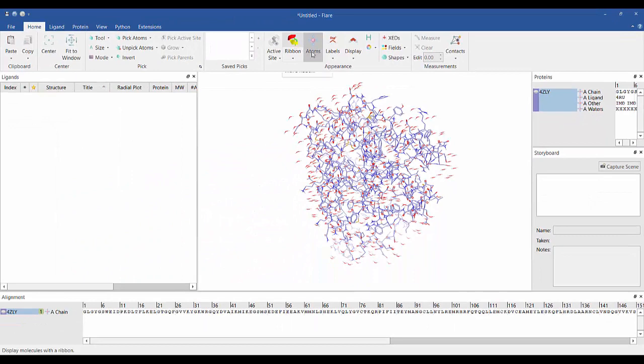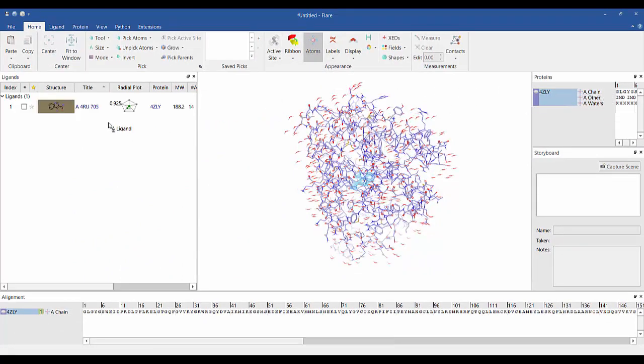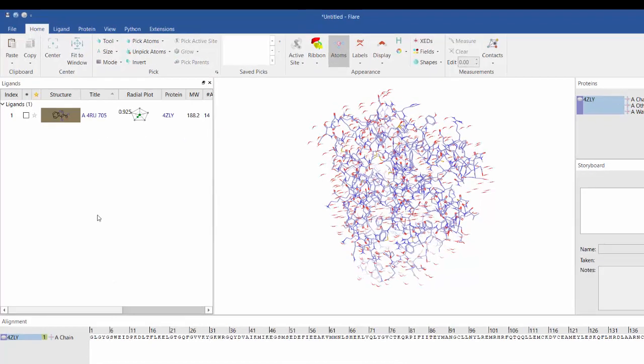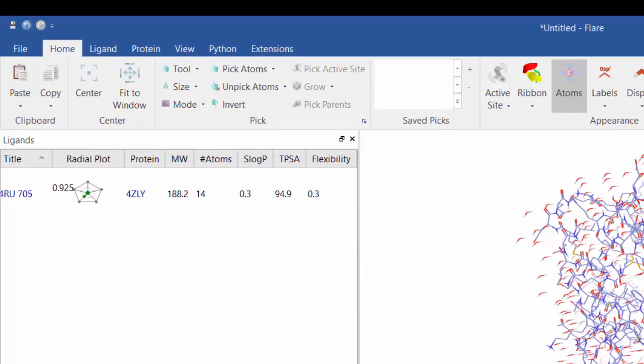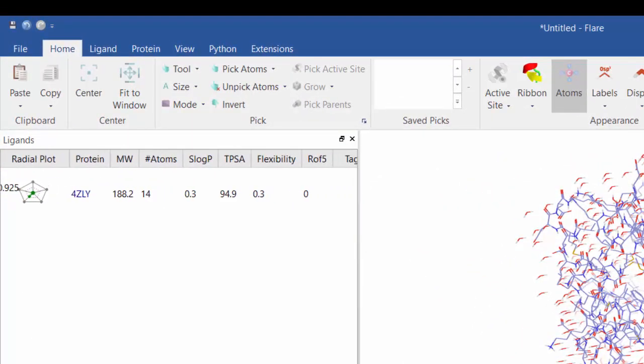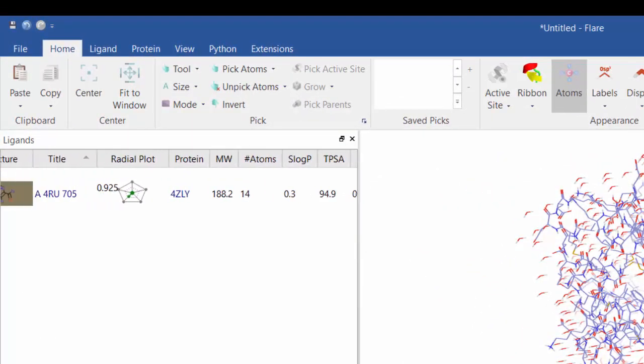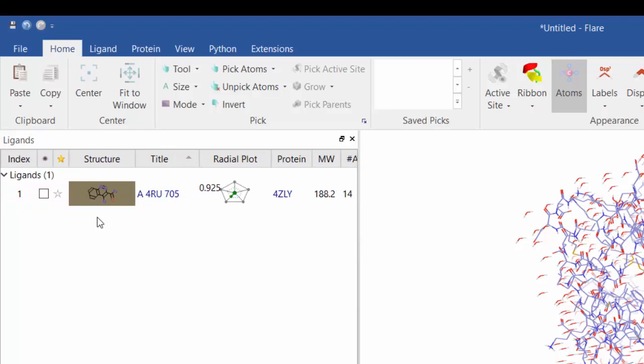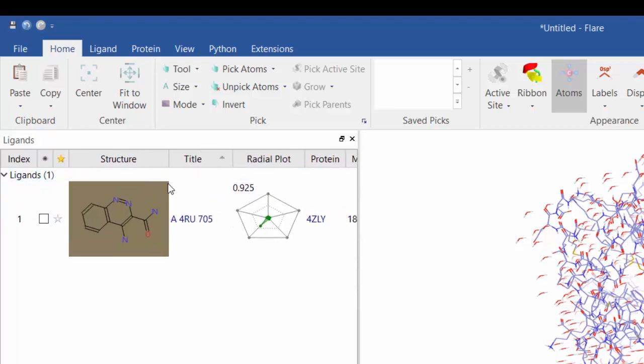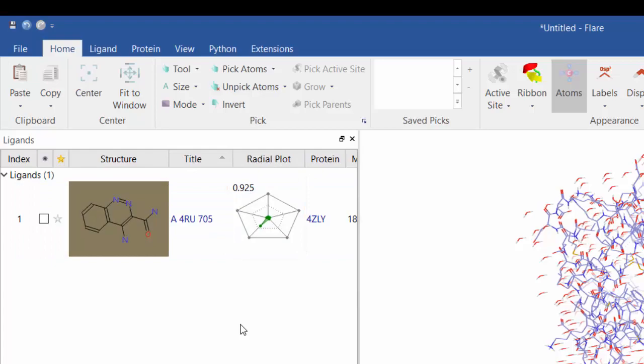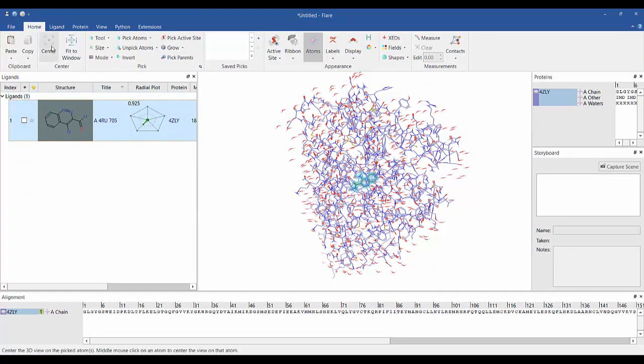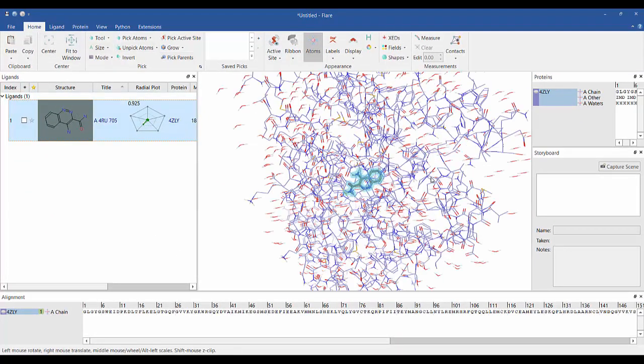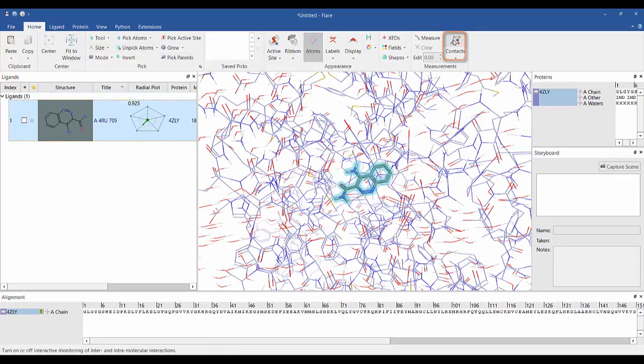Flare supports drag and drop, so the native ligand can be moved to the ligands table where you can view all physicochemical properties for the ligand individually but also conveniently combined into a radial plot. Flare calculates and displays a variety of non-bonded interactions which are provided under the contacts button.